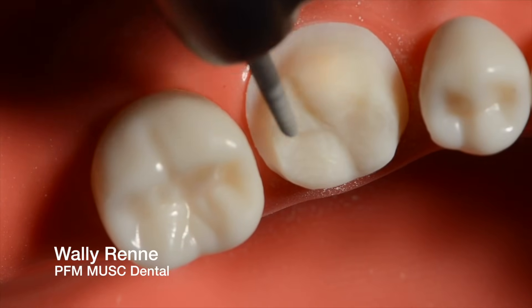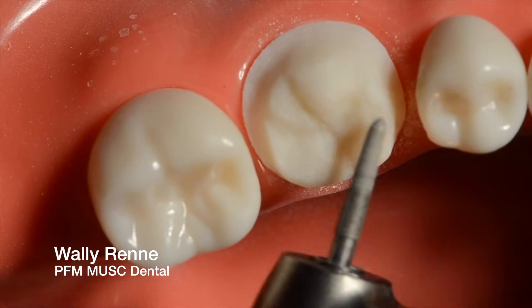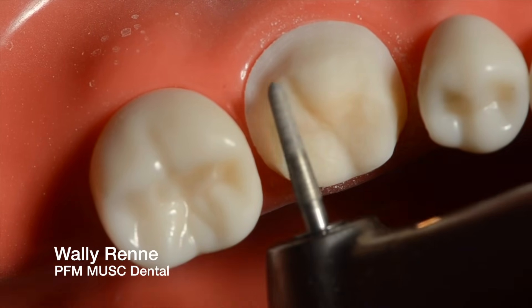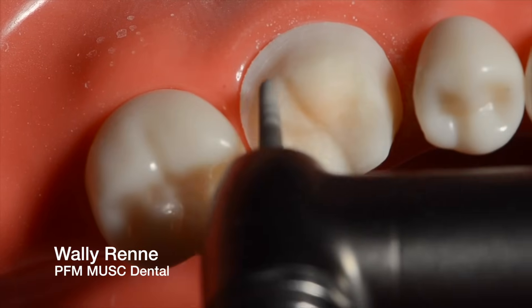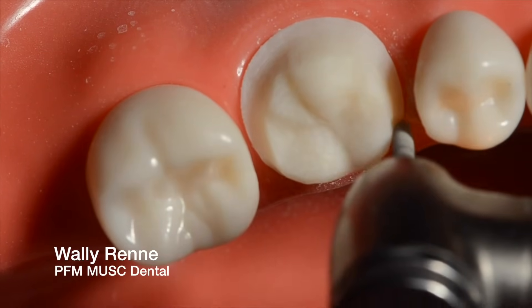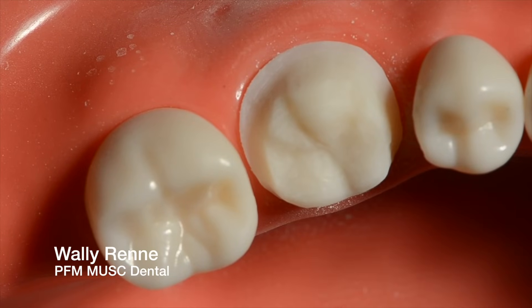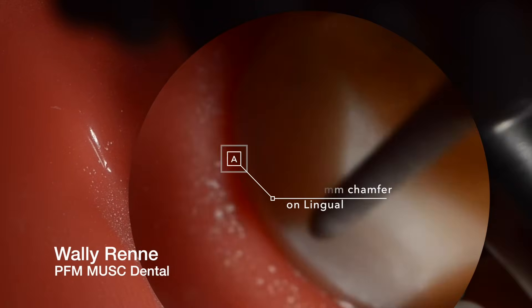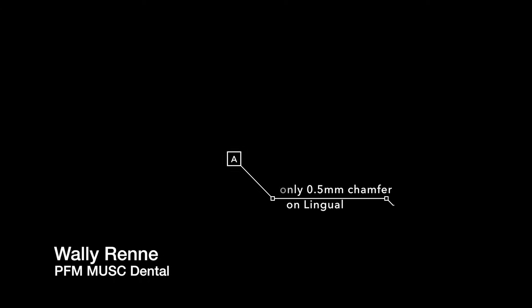Alright, so we are going to — now after we finish smoothing the occlusal, making sure there's no weird lumps that don't belong and sharp little grooves — we're going to accentuate that finish line. We're going to smooth it and make sure it's uniform in thickness: one millimeter on the facial, all the way through the interproximal, till about right there. Now we're going to transition to a light finish line — a half a millimeter gold margin. We've got an 016 here, and this is the light chamfer — no more than a half a millimeter — and it just blends right into that heavy chamfer.